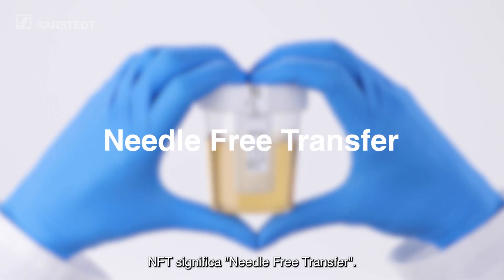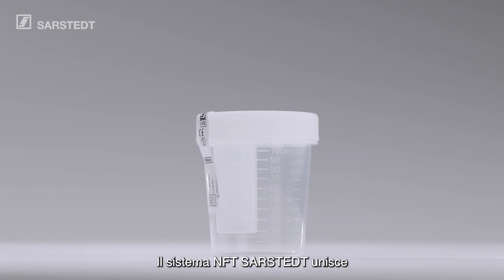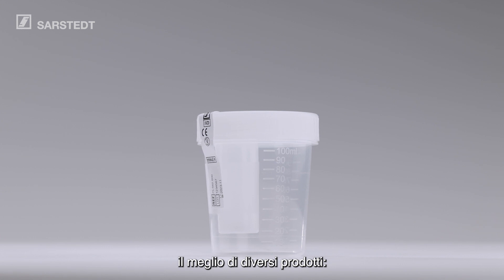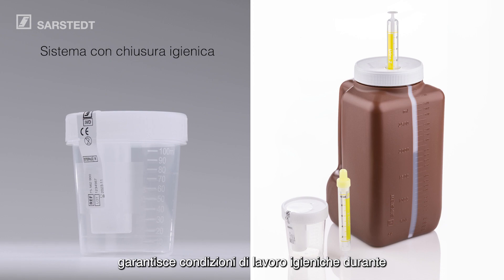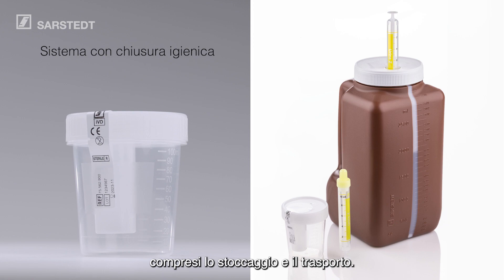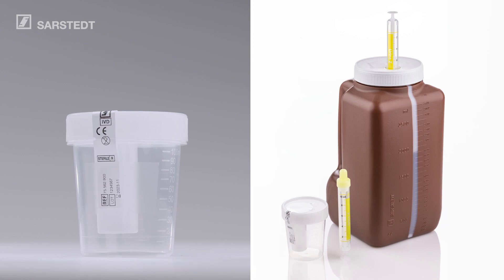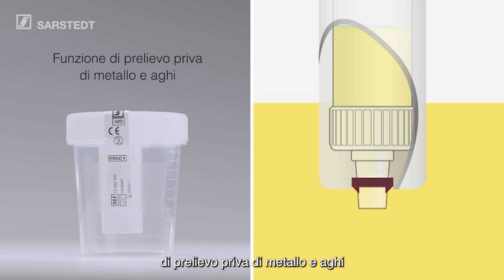NFT stands for Needle-Free Transfer. Sarsted's NFT system combines the best of different product ideas. The enclosed system ensures hygienic working conditions are maintained throughout the entire specimen collection process, including storage and transport. The sophisticated needle and metal-free collection function minimizes the risk of injury to patients and staff.